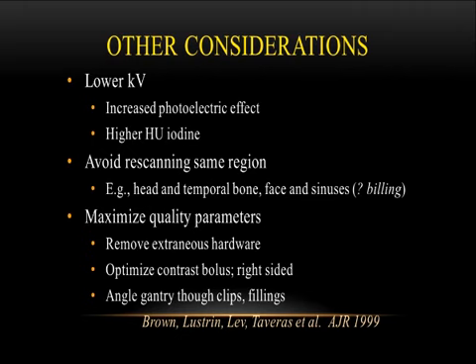And maximize image quality parameters. Again, remove extraneous hardware, optimize contrast bolus, and angle the gantry through the clips. So there have been some papers. If you're looking at aneurysm clips, you can tilt the gantry in order to avoid all the artifacts falling in one slice. Okay, very few people do that, but if that's your clinical question, is there a neck to this aneurysm, you may want to do that.